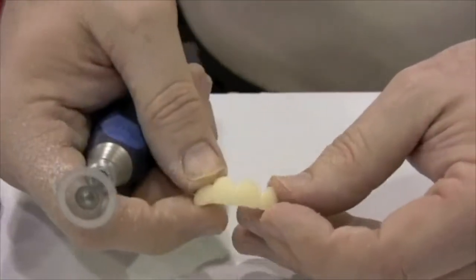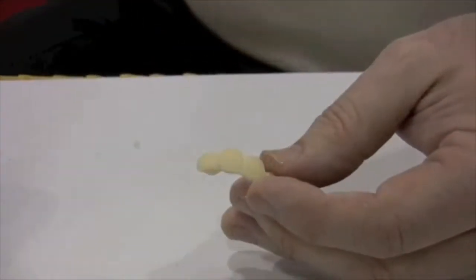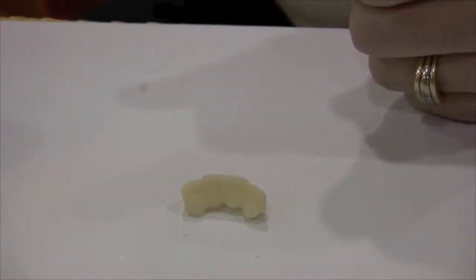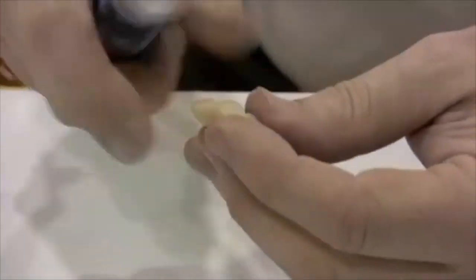We got a little bit of differentiation here. Now normally I would use a sandpaper disc to further refine. I don't have one here in the kit, so I'm going to switch to a finer grade diamond disc and smooth a little bit.